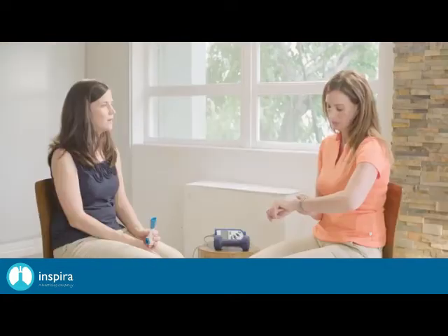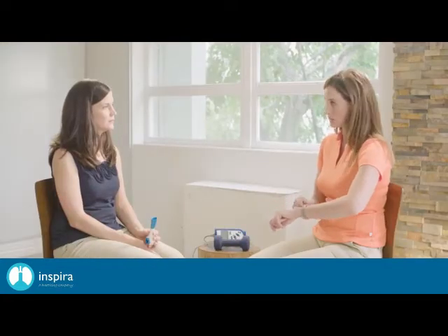Okay, so let's see how much air capacity you have to make voice. When you're ready, take a deep breath and say ah as long as you can until you run out of air. Whenever you're ready. Ah. Good. Okay. That was a 10-second maximum phonation time.